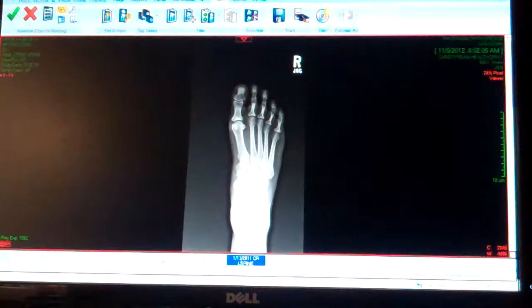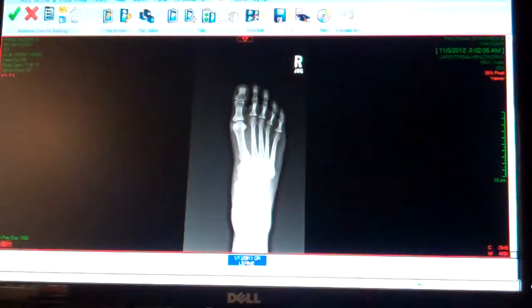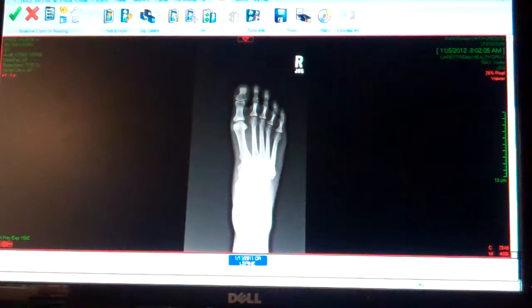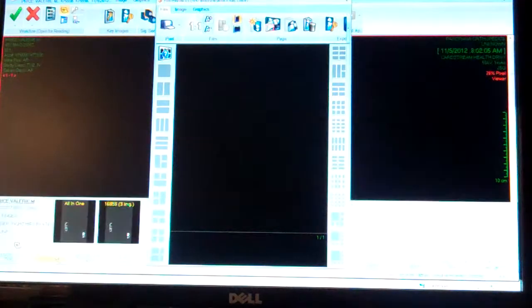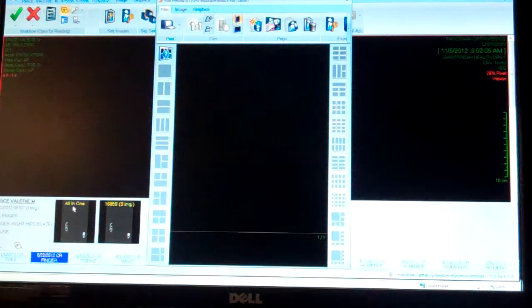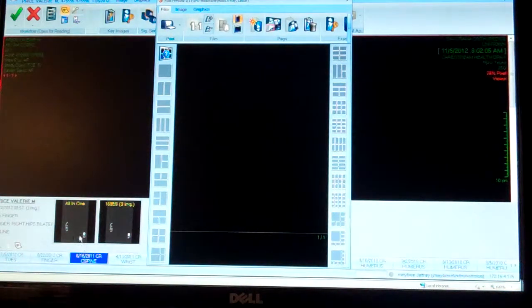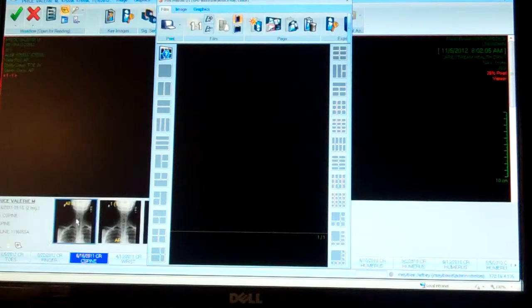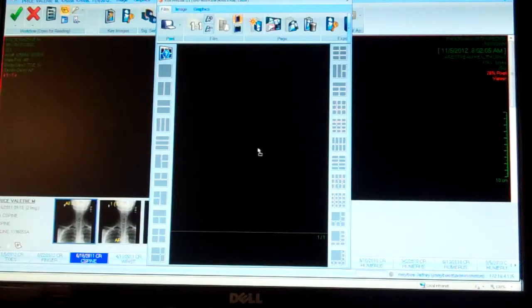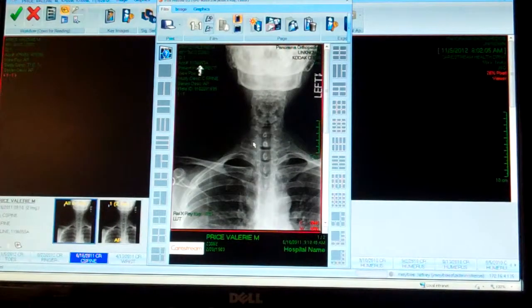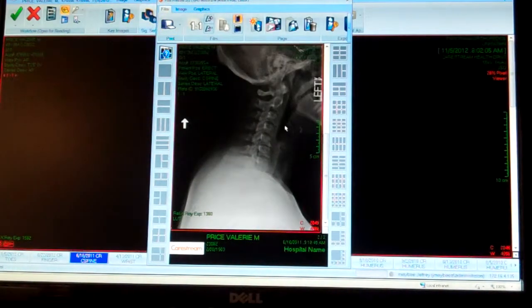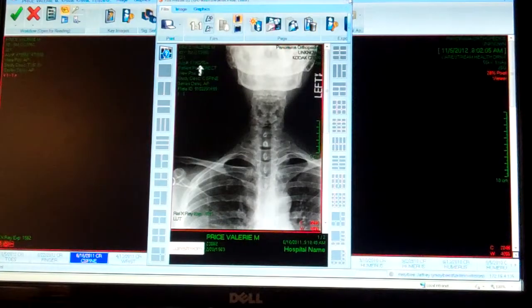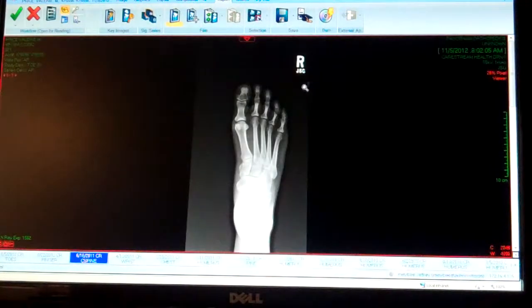To print, pull up the Print Preview screen and select from the strip the images that you want to load. Grab the all-in-one and drag over and you're going to hit Print just like you did before. Nice and simple.